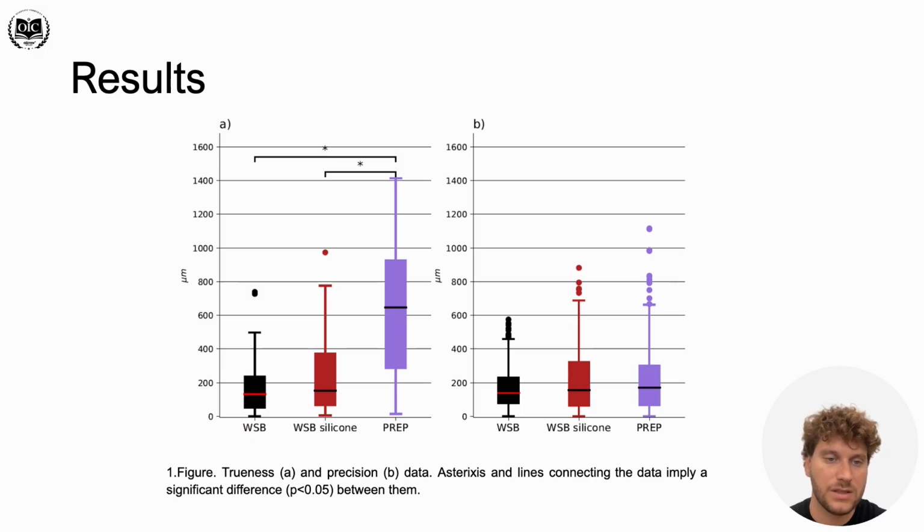And we found some statistically significant trueness differences between the pre-preparation and other bite registration methods. And this suggests that these kinds of pre-preparation techniques with removable denture should be used with caution, because the results indicate bigger occlusal deviations than the other two methods. There was no statistically significant difference regarding the precision.